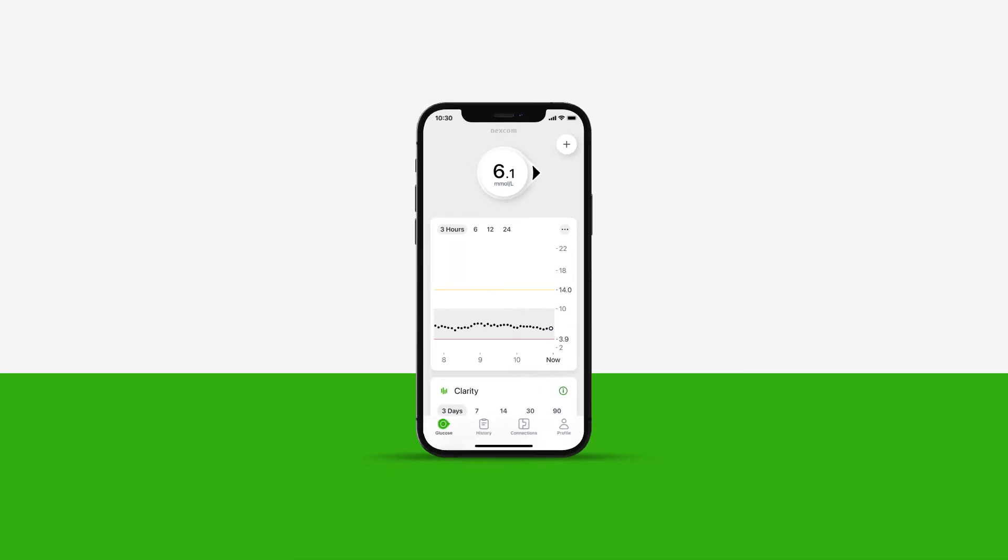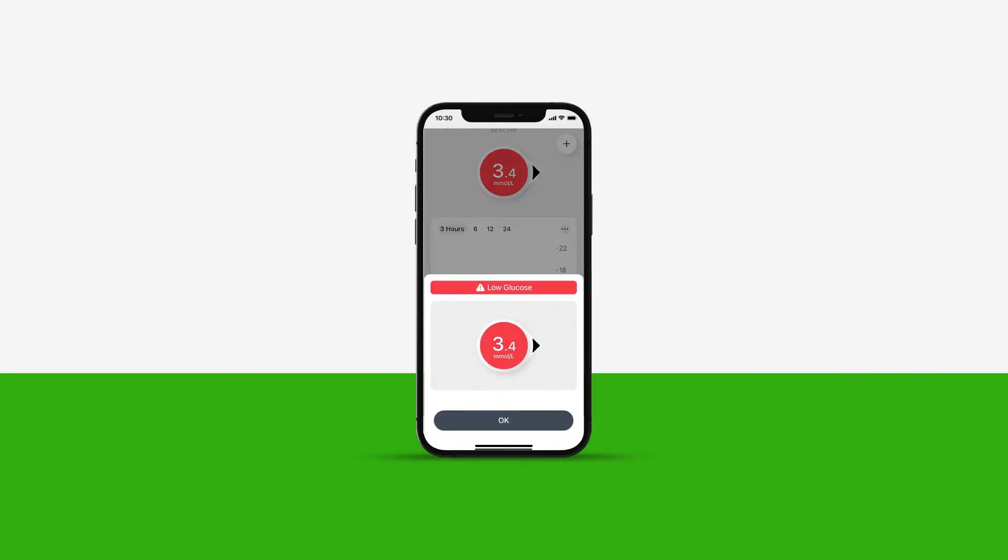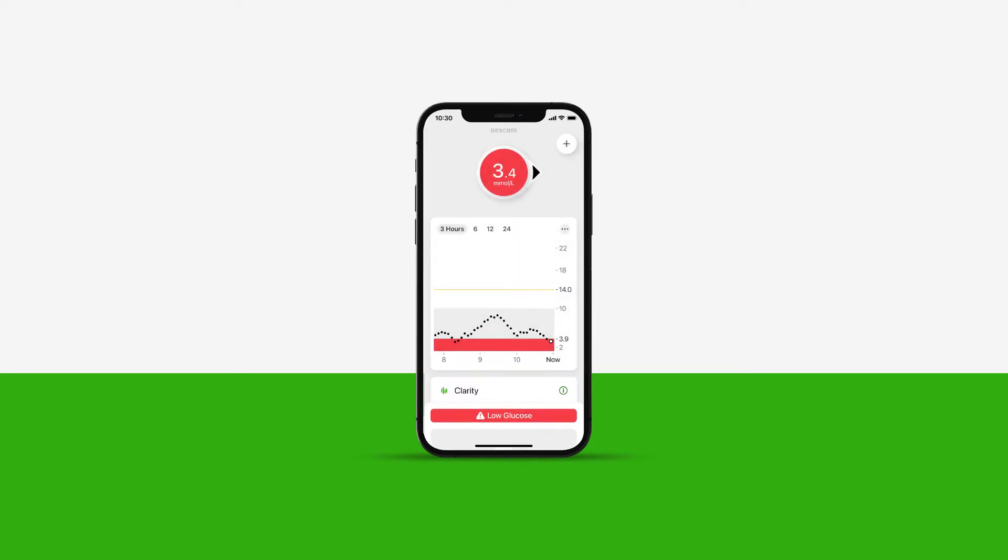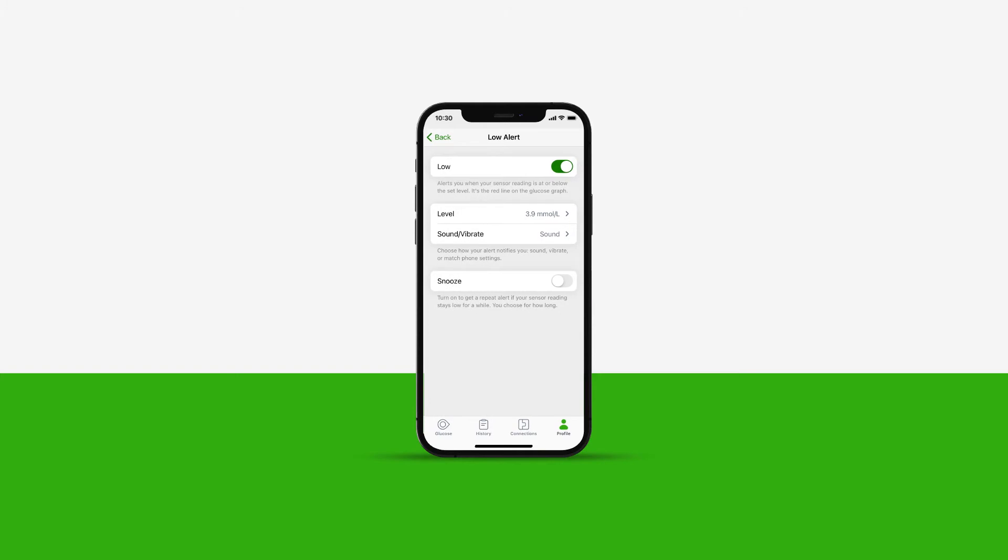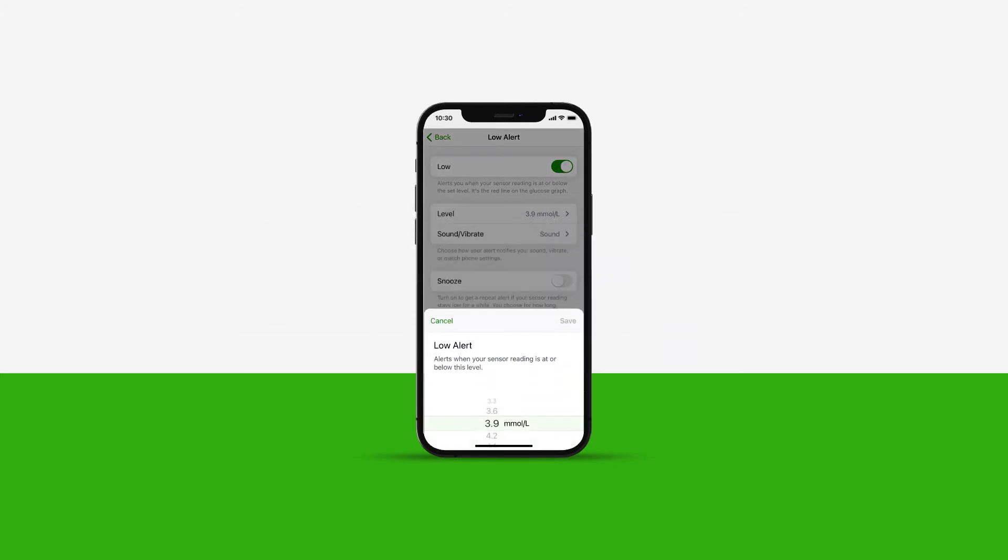Your low alert is the red line on the glucose graph. When you are at or below your low alert setting, the app alerts you and the circle turns red. To customize low alert, tap into the alert. Here you can choose the level you want to be alerted at. Once done, tap Save.